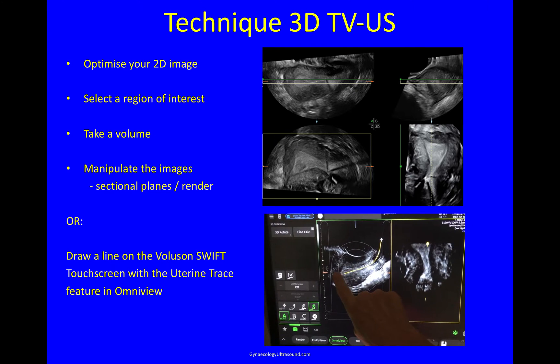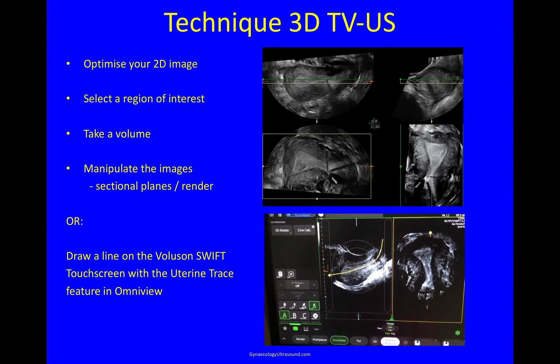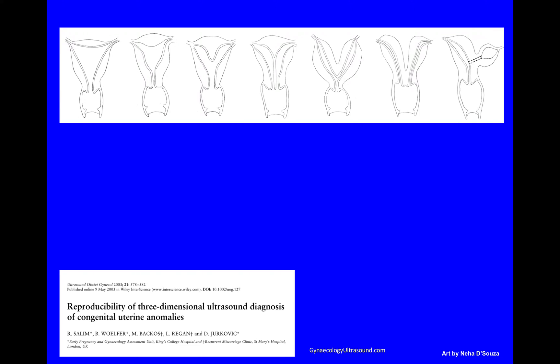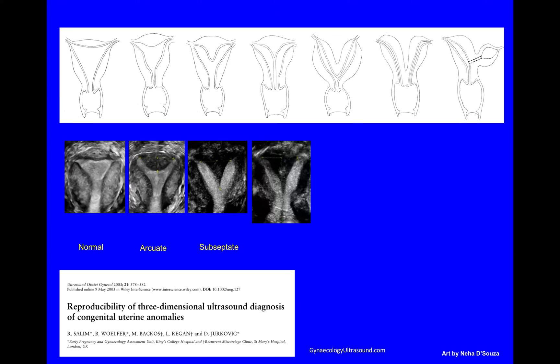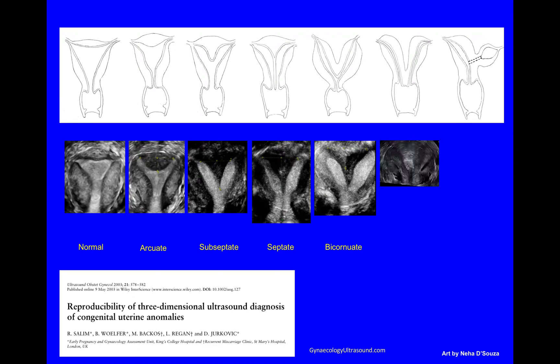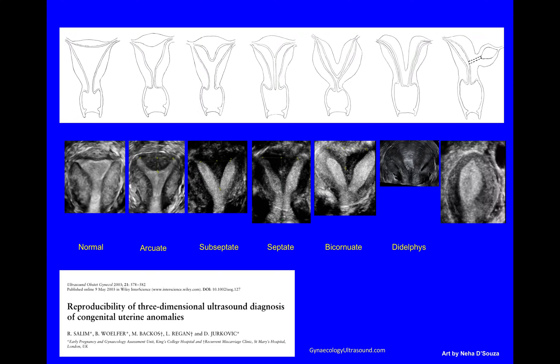There's the longitudinal view of the uterus and there is the coronal plane. Which classification system you use depends on your personal preference — there are many available. This is the one we use: here you can see a normal uterine cavity, an arcuate cavity, a subseptate uterus, a septate uterus where the septum goes all the way through the cervix and possibly the vagina, a bicornuate uterus, a uterus didelphys, and a unicornuate uterus with or without a rudimentary horn.